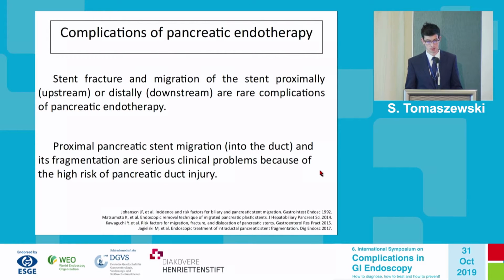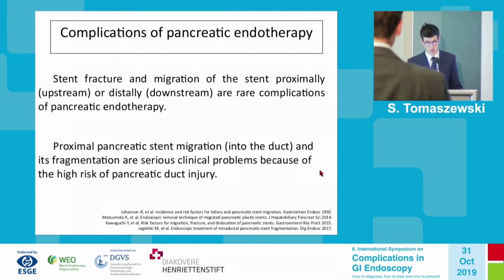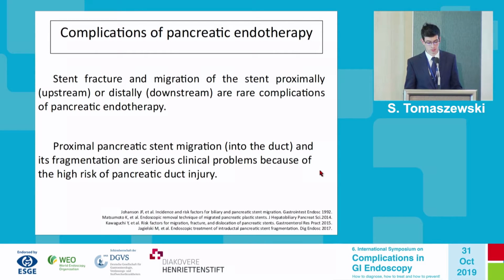This is a very rare complication of these procedures performed in chronic pancreatitis. The stent fracture and migration of the stent can be upstream, proximally, and downstream, distally.